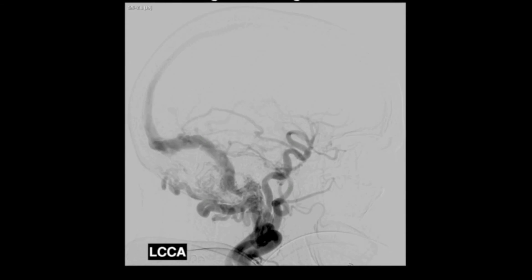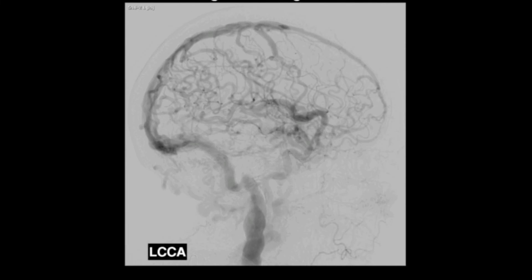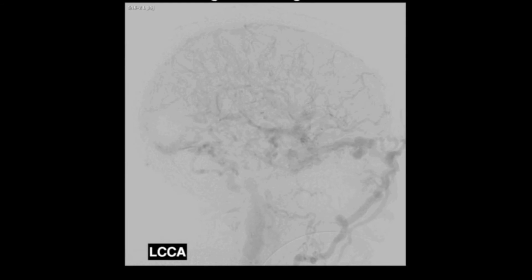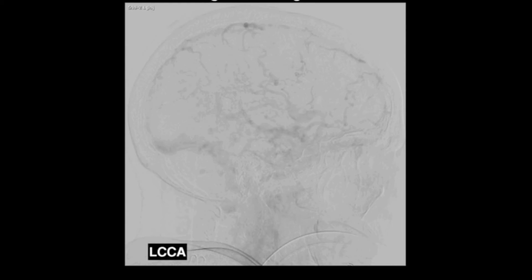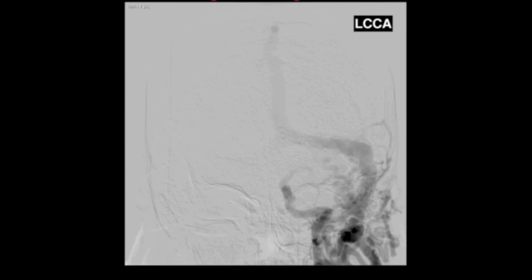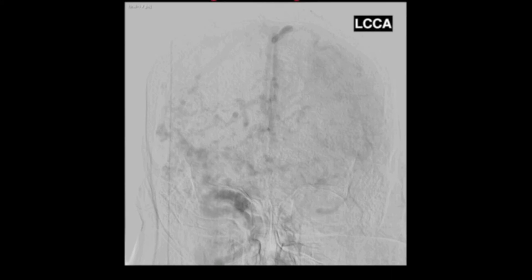Repeat angiography demonstrated similar but worsened angioarchitecture of the complex left-sided dural arterial venous fistula. Importantly, this is a rare situation where the occluded sinus is ipsilateral to the fistula and drains only the venous outflow of the fistula itself. This presents a rare opportunity to employ the dual microcatheter technique and embolize both the fistula and the sinus.